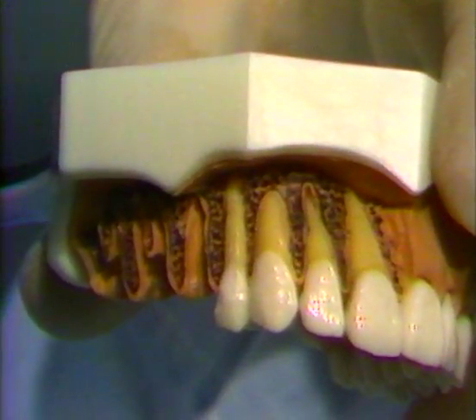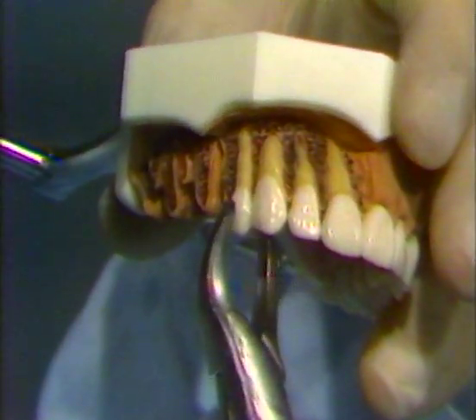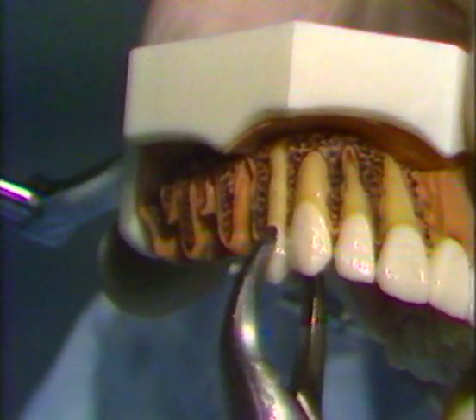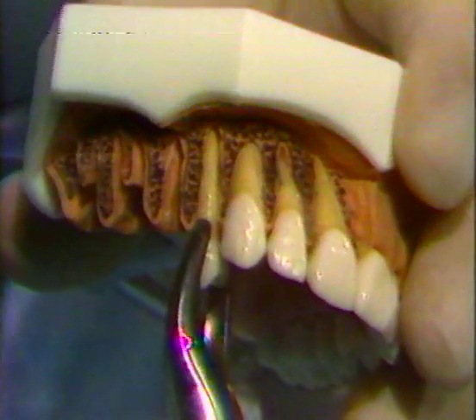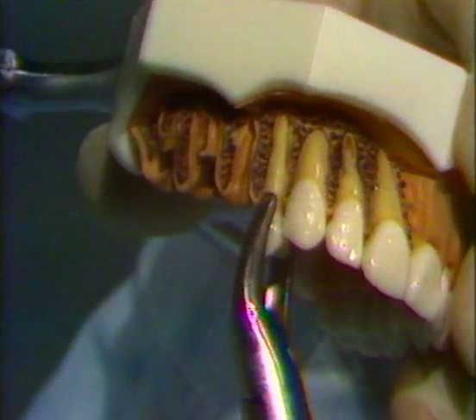The maxillary first bicuspid is a double-rooted tooth. Again, the first step is to properly seat the forceps and gently push up into the socket. The next movement is toward the buccal, then toward the palatal side. This is followed by a downward movement in the long axis of the tooth, resulting in delivery of the tooth.